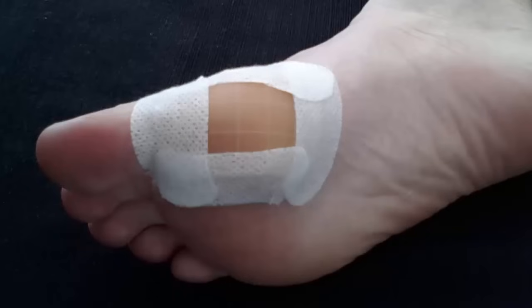And now for a quick bonus tip. Compeed is really sticky, but it's common for an edge to roll back and stick to your sock. The Compeed in your sock, they bunch up and that lump can actually cause a blister. So my advice is to always anchor the edges of your hydrocolloid dressings with Fixomull or some other tape that you trust to stop that rollback.